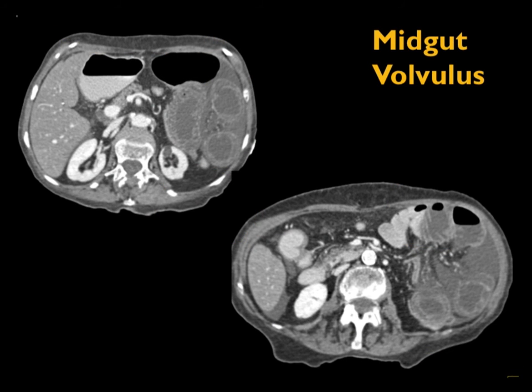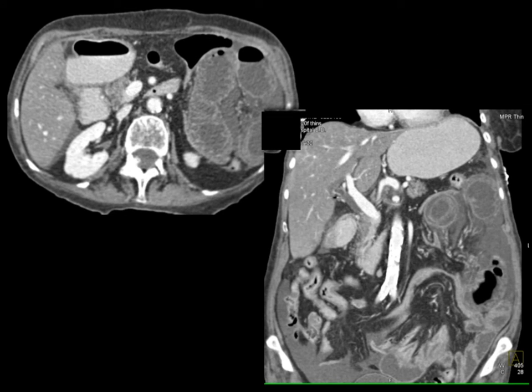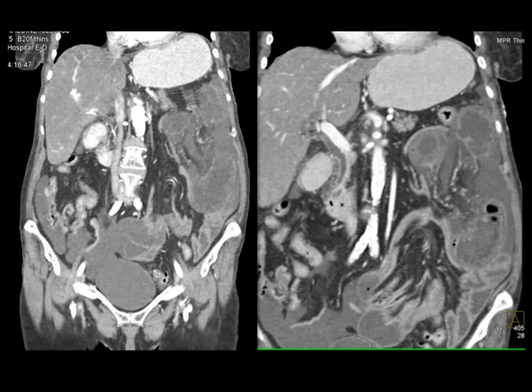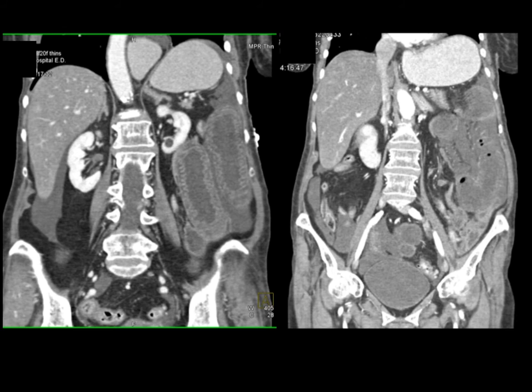Here's another case — dilated loops in the left upper quadrant with ascites around those loops but nowhere else. The bowel is dilated and thickened but seems to be pushed. The rest of the bowel is not dilated. When you see thickened small bowel folds on the coronal view, there's also ascites around the bowel loops. When I see dilated bowel with ascites I'm always thinking about ischemia. It almost looks like there's a twist in the bowel. Analyzing the vessels carefully, the bowel is hooked into the left upper quadrant — it's an internal hernia. There's ascites suggesting ischemia, and edema of the bowel. This is a surgical emergency.